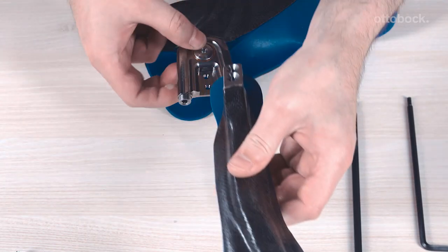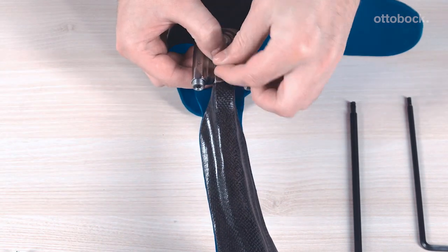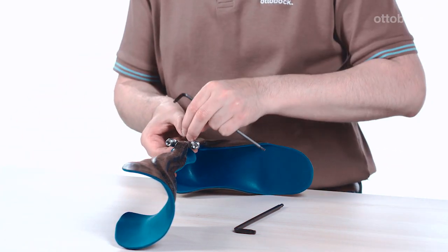Install the lower leg shell by using the two countersunk head screws to screw the lamination bar to the basic piece. The two screws must be tightened using the specified torque and secured with Loctite 241 during final installation.